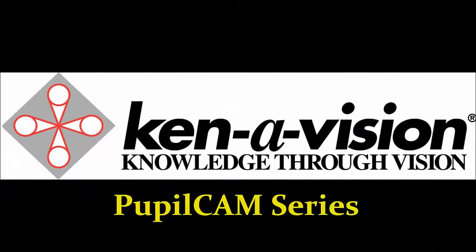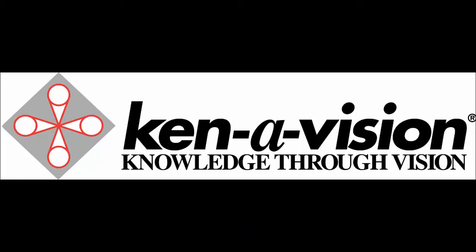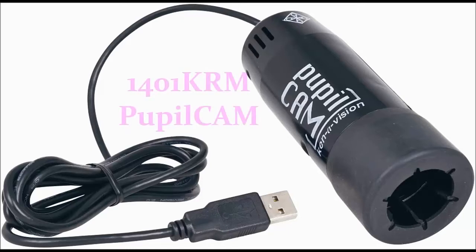The Kinevision PupilCam is a high-resolution HD specialty camera designed specifically to fit on your microscope. Kinevision offers two models of PupilCams.